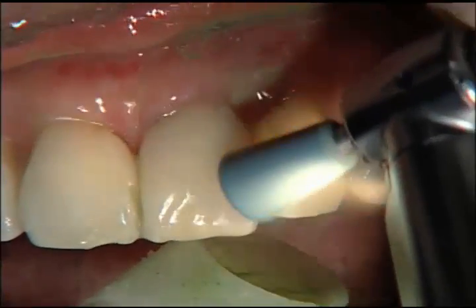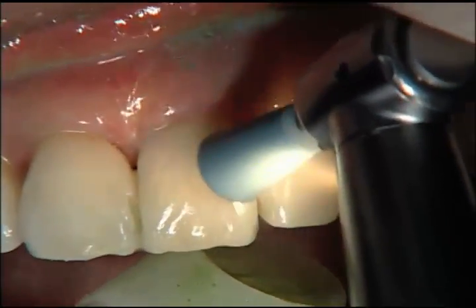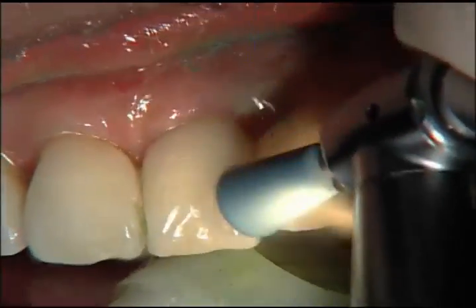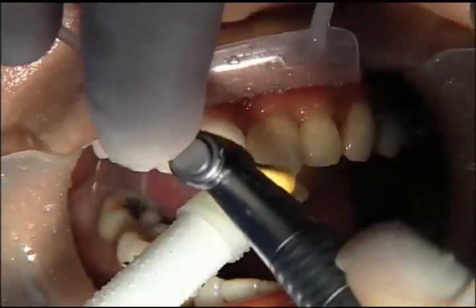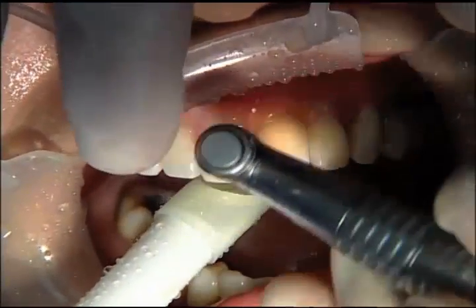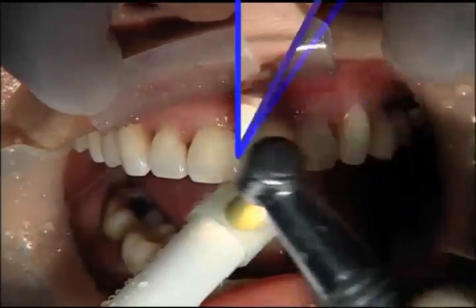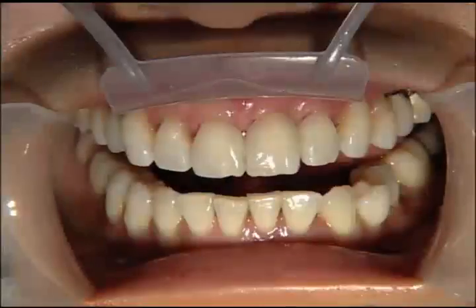Once we've done the recontouring of the porcelain material, we go to the beginning of the polish with the blue cup, which gets it quite smooth despite the roughness the green set creates. The blue cup also comes in a disc and point shape and will really smooth things off. Then when we want the wet, high-shine back on our ceramic material, we switch to the yellow. As our polishing materials become more fine, we turn the water on because of the increased heat generation. We're also using a finishing strip from 3M to go in and make sure we've smoothed off all the interproximal areas where we may have some cement left.